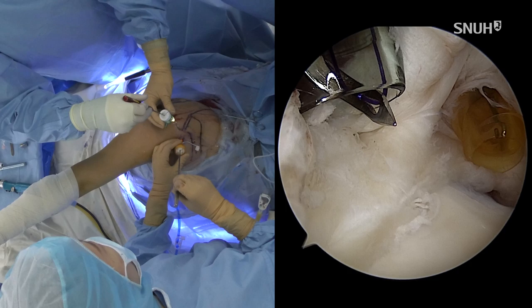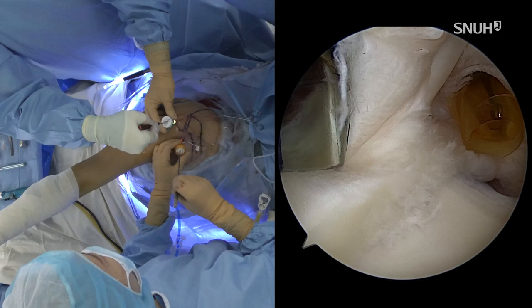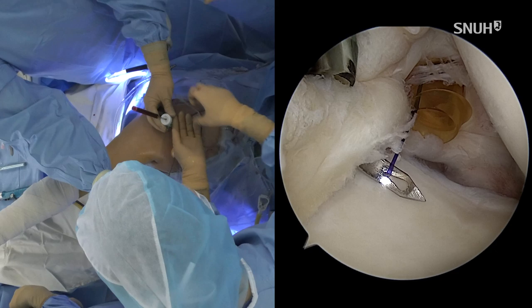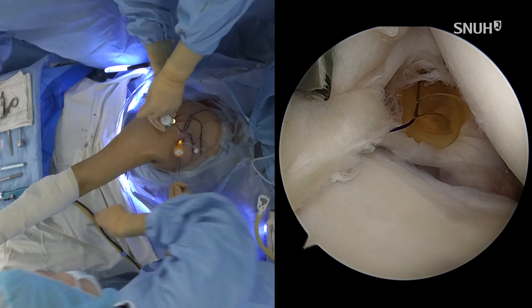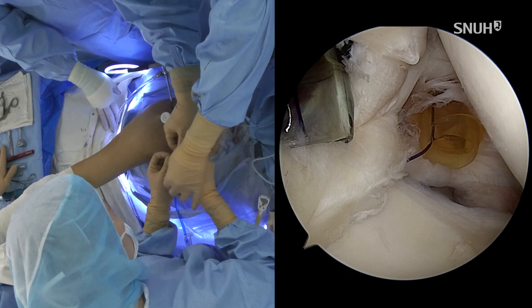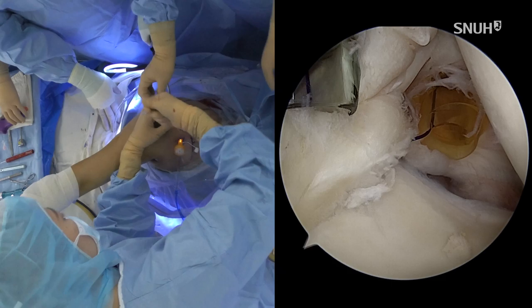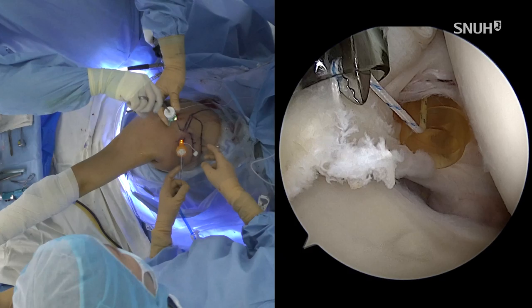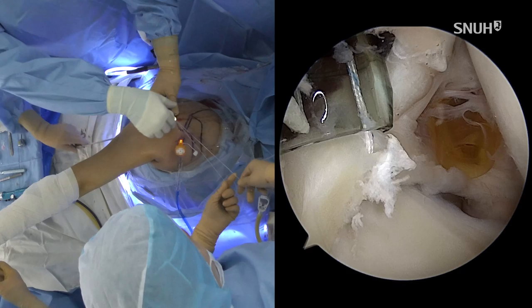So with a suture hook from the transrotator cuff cannula, suture the superior labrum as deep as possible here, and then retrieve one suture through the anterior cannula. Then relay one FiberWire. And the other limb of the FiberWire is through the transrotator cuff portal, like that way.